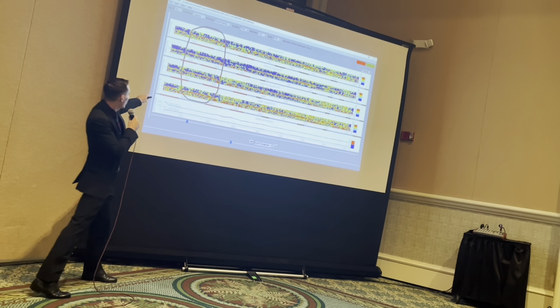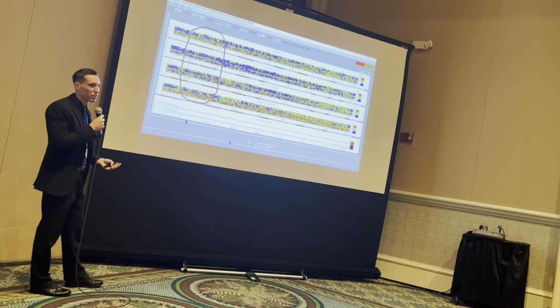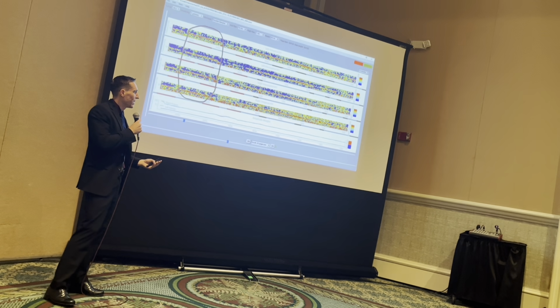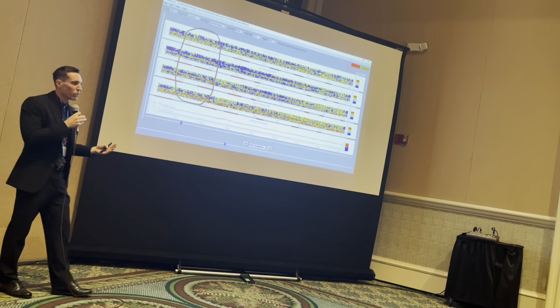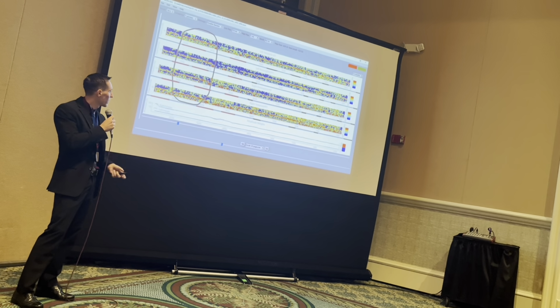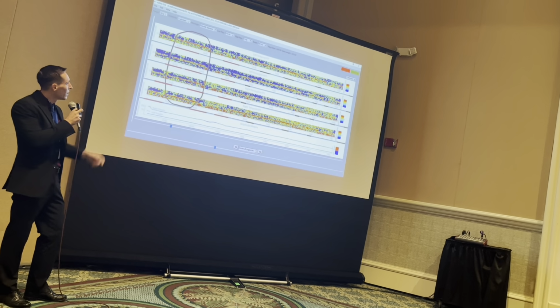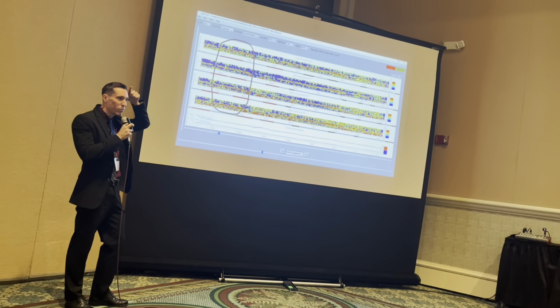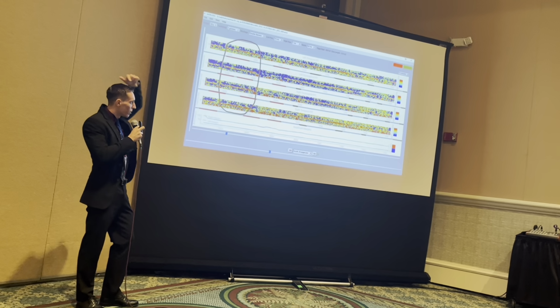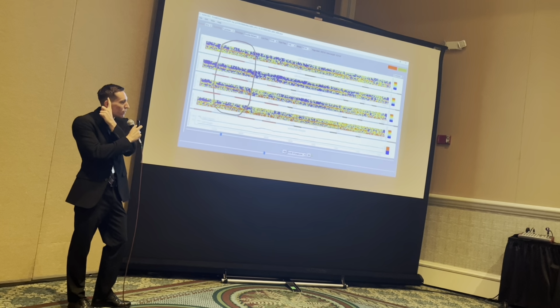Now, if we want to take this to its extreme, we can take the frequency graphs we were looking at, and we can split it up into 4 different ones. Why would we do this? When we look at a double banana montage or longitudinal bipolar montage, it's separated into 4 different chains. You have your left temporal chain, which is on the left side of the head. You have your left parasagittal chain, which is essentially the left top of the head. Right parasagittal, which is the right top of the head. And then the right temporal, which is on the right side of the head.